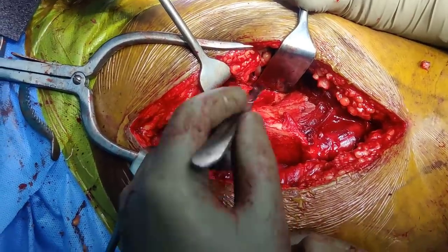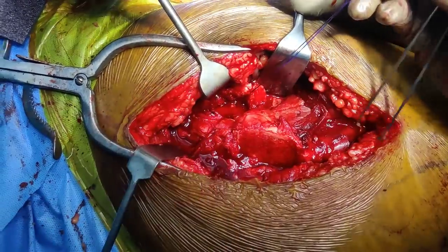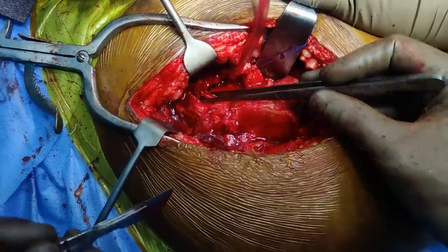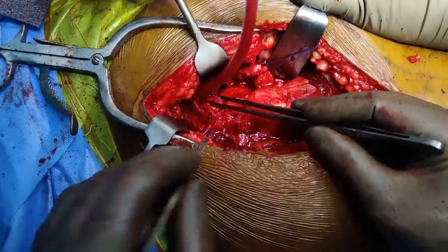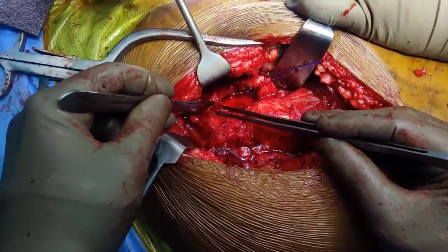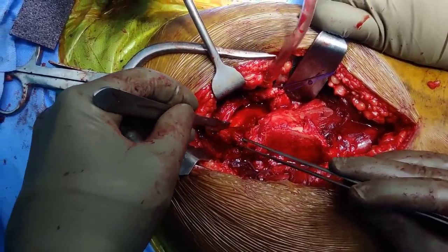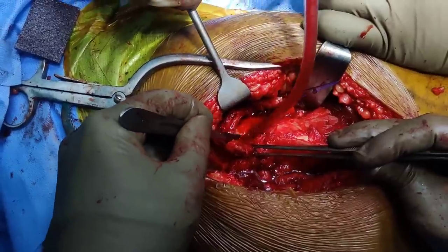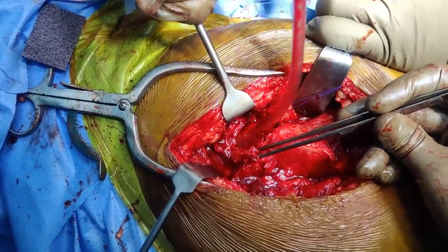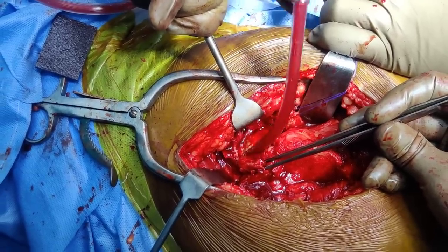Lift up the first and second limbs and dissect inferiorly, trying not to use the cautery in this area. Take a number one vicryl and put a corner stitch and then reflect it. You can see the labrum, so go superiorly gently and open the third limb of the capsulotomy. Then put some vicryl, reflect it, give a wash, and you will be able to see better.